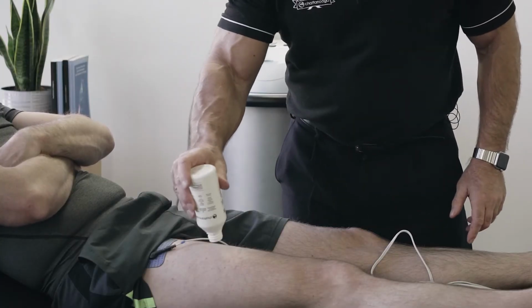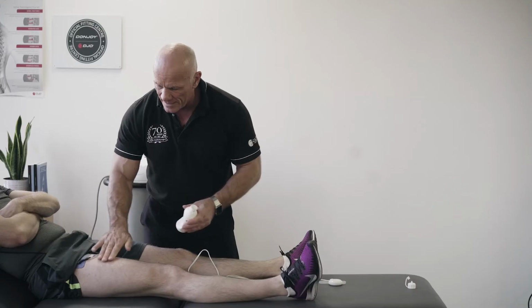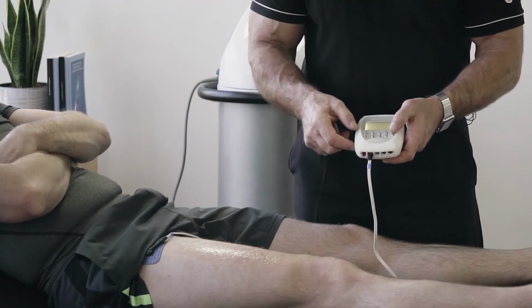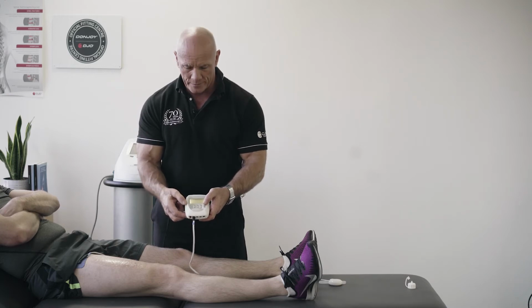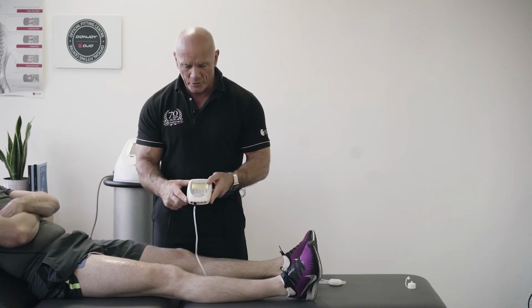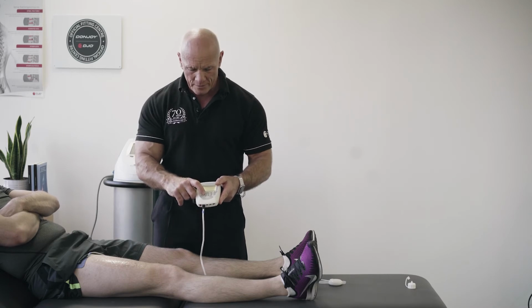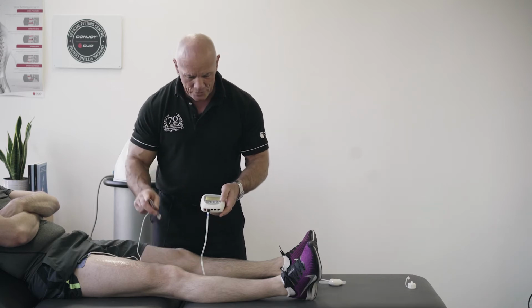To help our impulse with the motor point pen, we just cover the muscle we want to look at in a water-based gel. We go into our program and find a program called motor point. Specific frequency for finding motor point, and we enter. We have a body chart because the pulse width varies around your body. So we choose the correct area with the correct pulse width. We press enter.